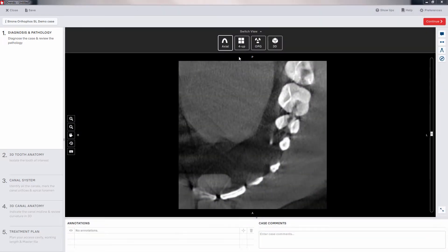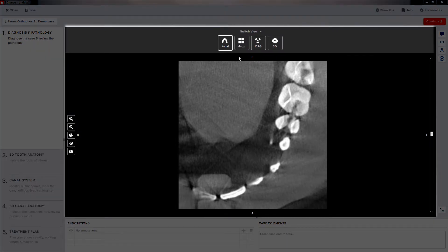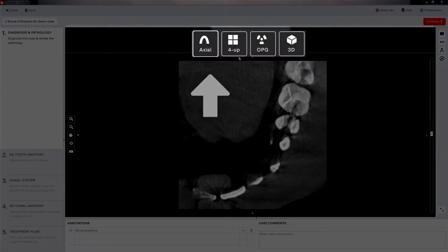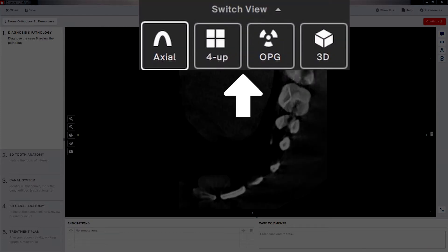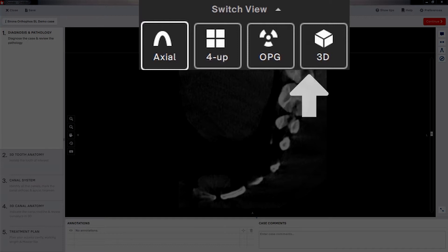The second area of the window is your main viewing screen. This is where you can see and manipulate all of the different views available. Navigation of the different views is across the top of the section.